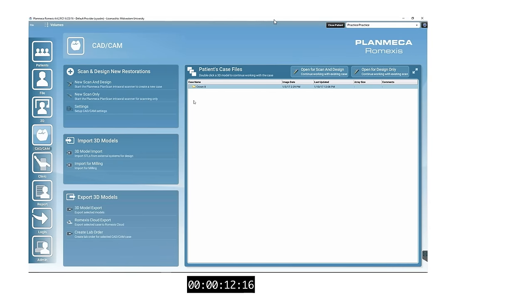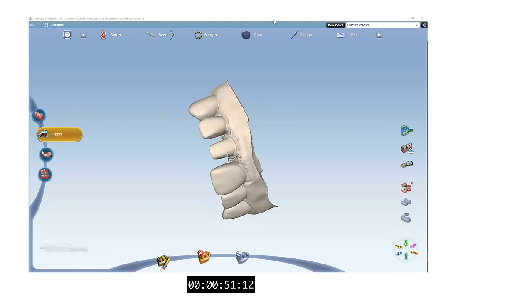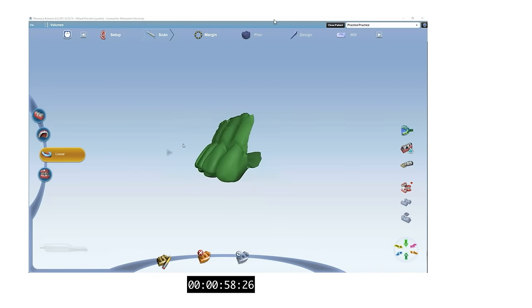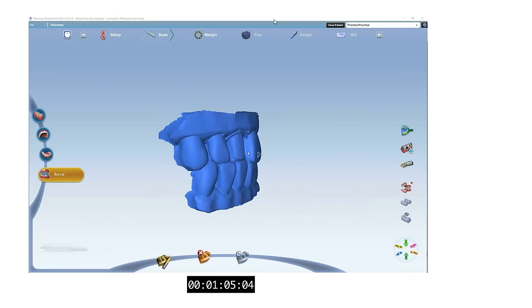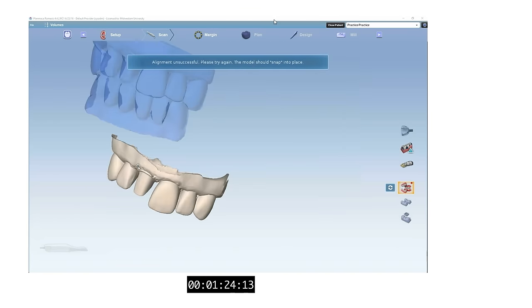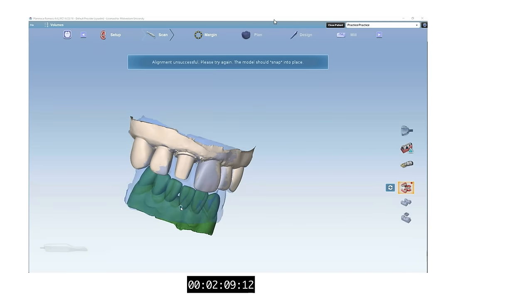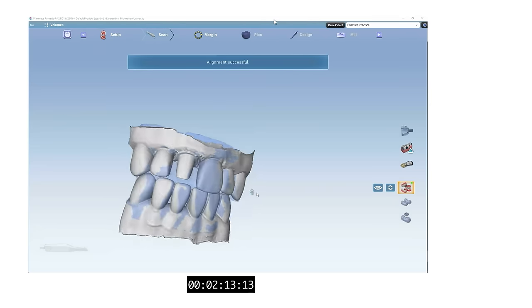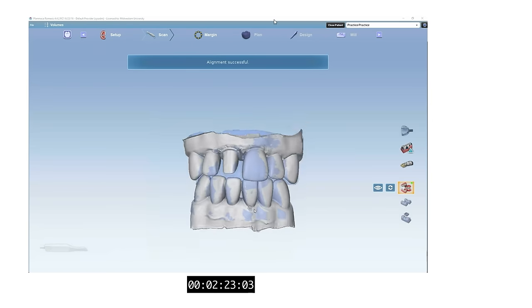For this video, we will be using PlanScan's E4D software to design our crown. There are generally three scans needed: the scan of our prep, the opposing scan, and the buccal scan of the prep with the patient occluding. Using the buccal scan, we can align the prep scan with the opposing scan to establish a three-dimensional relationship between the two arches. Since we are dealing with the aesthetic zone, scanning from canine to canine will help when designing number eight.